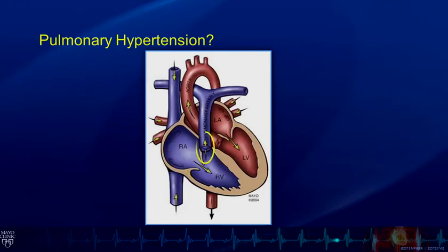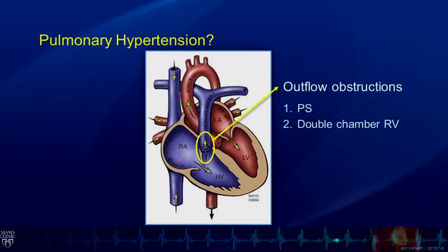obstruction. So anytime we have a high tricuspid valve regurgitation velocity, we need to consider whether or not there is some outflow obstruction into the pulmonary artery, including valvular or subvalvular pulmonary stenosis, or with certain types of ventricular septal defect, an entity called a double-chambered RV, where there's heavy muscle bundles in the mid-ventricle of the right heart that can cause obstruction and cause a high-pressure proximal chamber to the tricuspid valve, but a low-pressure distal chamber.